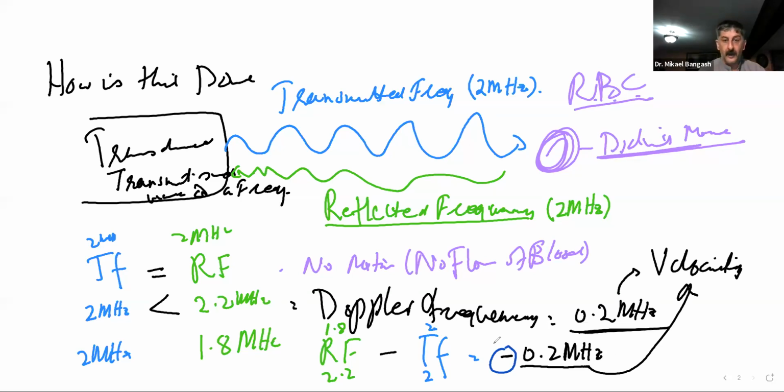As far as the frequency here is concerned, it is just calculating the speed part of the velocity. Say, for instance, that 0.2 megahertz could mean that the structure was flowing at a speed of 2 meters per second.